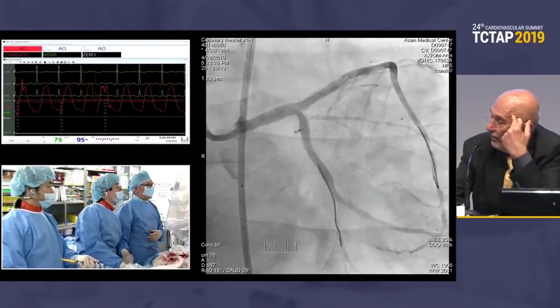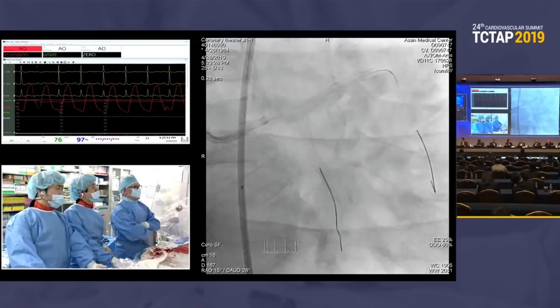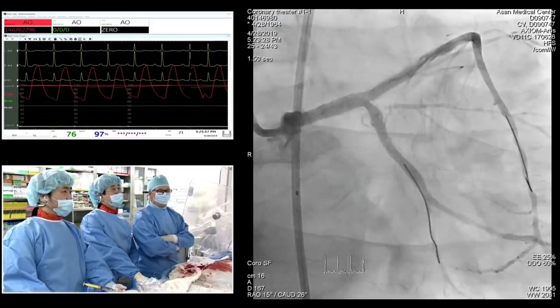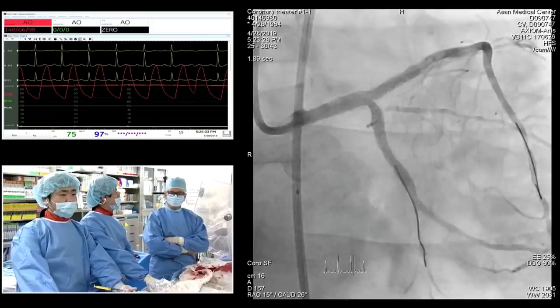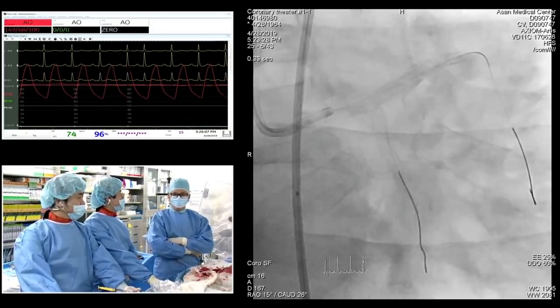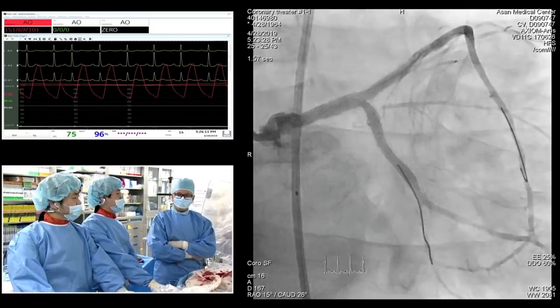I think it's good. The stent area is more than 5.5. It's not suboptimal, low ischemia. I think it's good to leave it like this. If the patient comes back with restenosis, then that could be another option, to put another stent. If you put a stent now, he will not have any other option there.